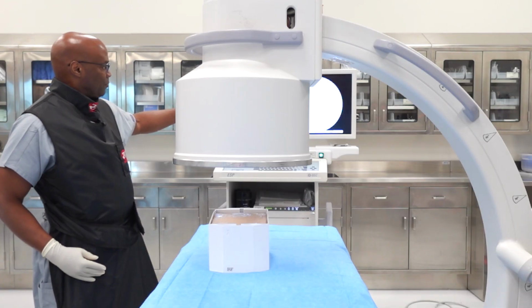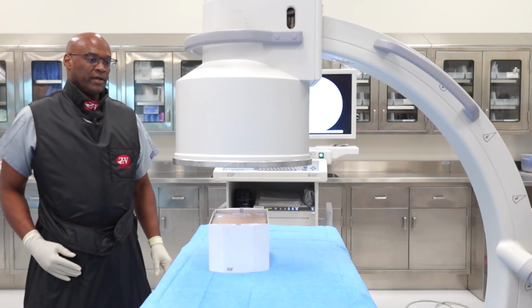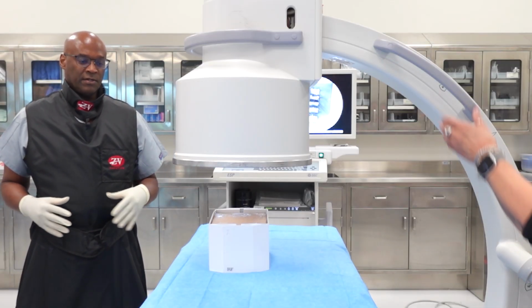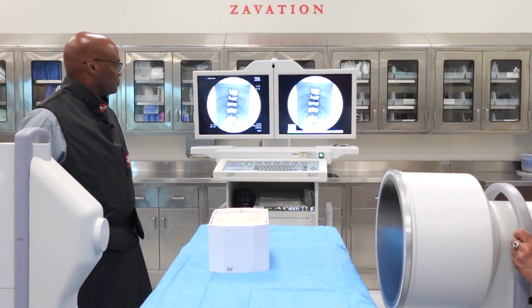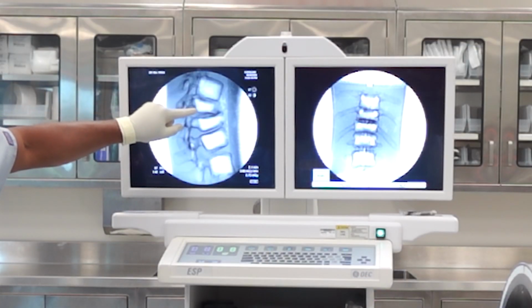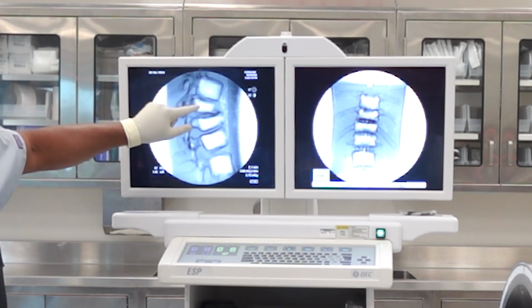Our first compression deformity that we're going to treat is at T12, which is right here. Now we're going to swing the C-arm to a lateral position to look at the configuration from a lateral approach. As you can see here, this is the T12 compression deformity. We're going to access this vertebral body initially in this training video.